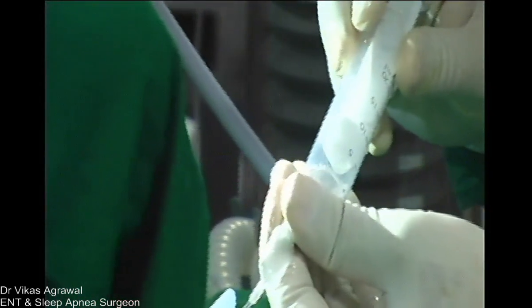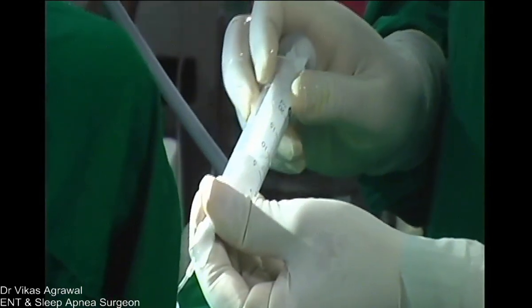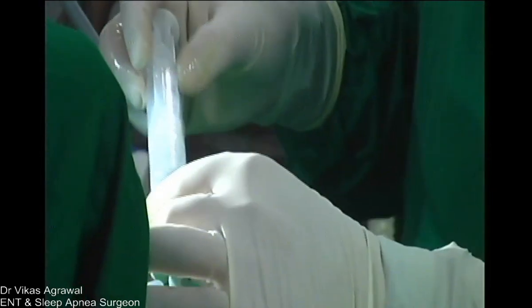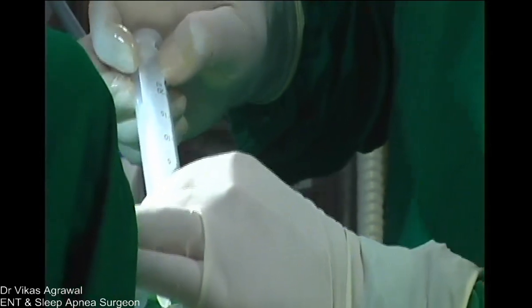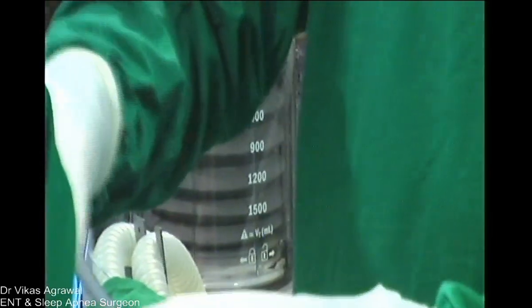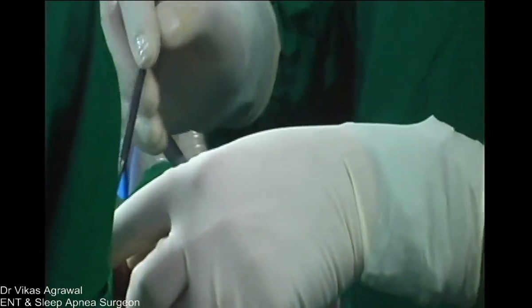Yeah. Now I'm inflating with around 8 to 10 cc's on each side. And then we'll measure the pressure. Our surgery is over. I've inflated with 8 to 10 cc's on each side. And there is a small hole for him to breathe. This is only useful for the first 5-7 minutes as he comes out of anesthesia.